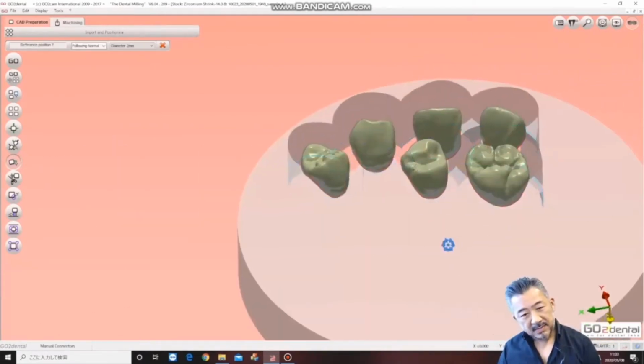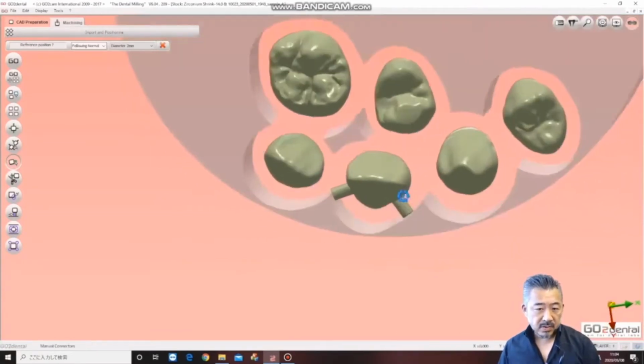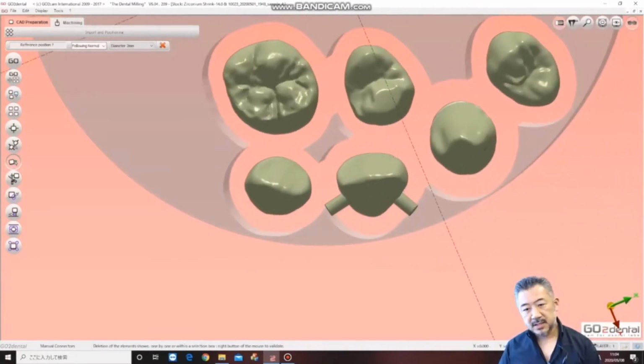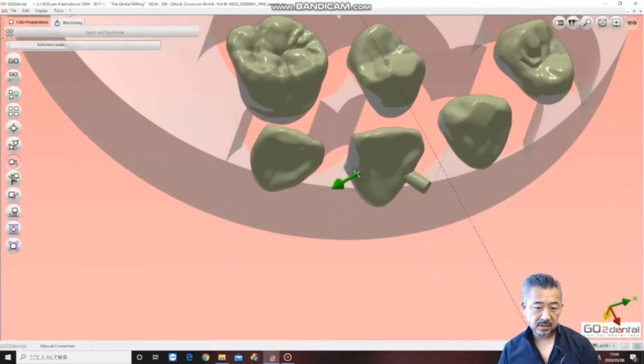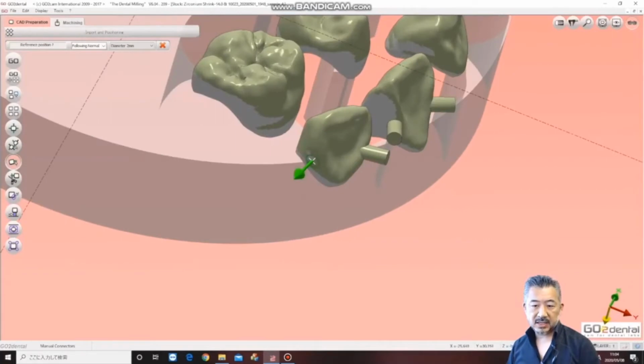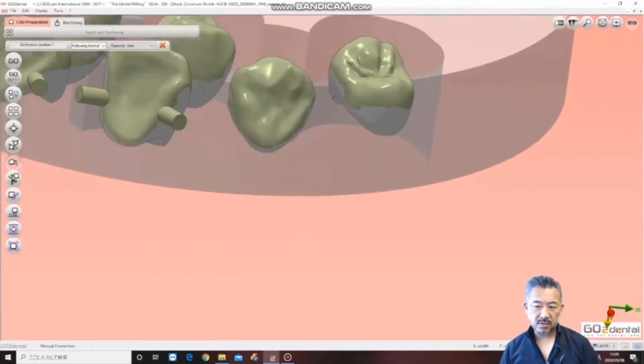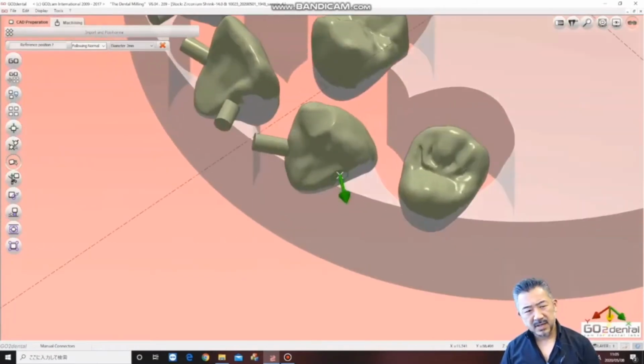The bottom of the disc here is the surface of the zirconia disc. This is because the back of the disc is facing up when setting the clamp of the milling machine.